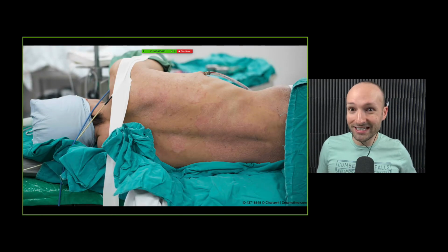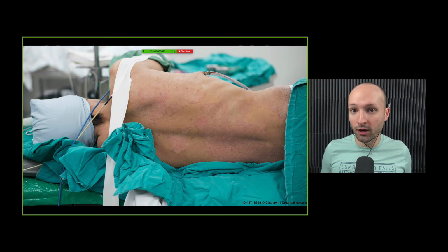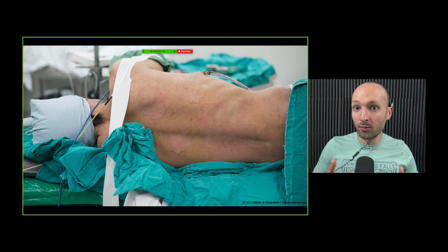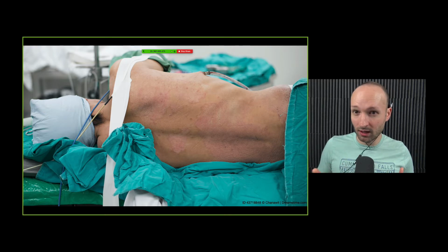Now, if you have an intubated patient, what I usually do is I do this with help. So I have another person in the room. I'll move them over to their side, making sure that somebody is paying attention to the ET tube. Put the bed rail up on the side that you're going to be moving them to. That's obviously going to be the side towards the ventilator. And then I look at them basically on their side.